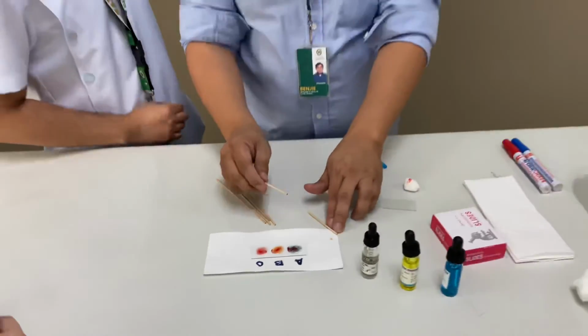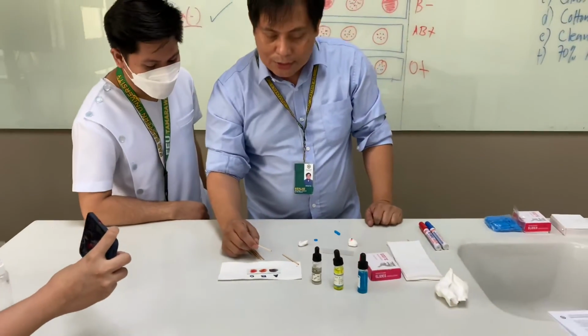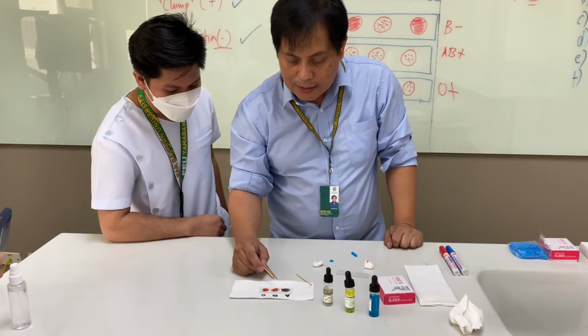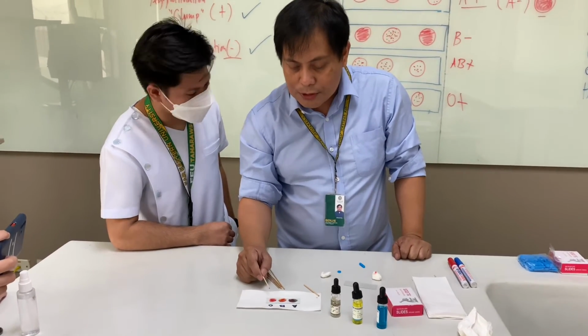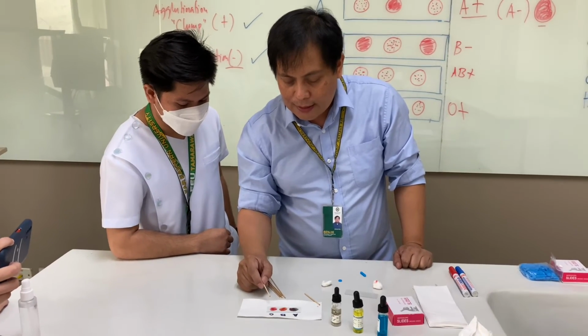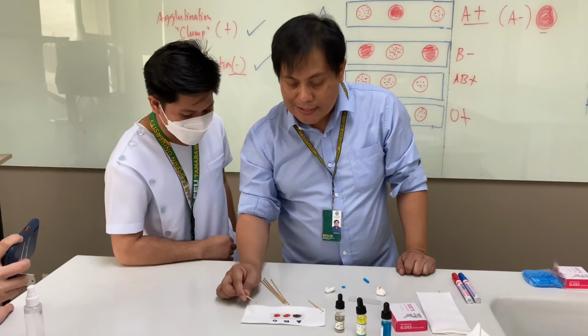In here, you can see there is agglutination in A. Likewise, in B, there is agglutination, and obviously, the D in here represents being positive.